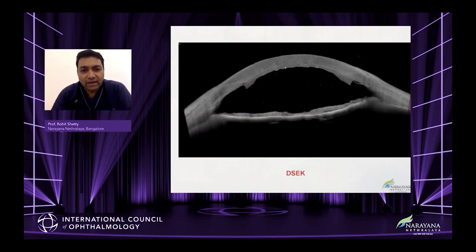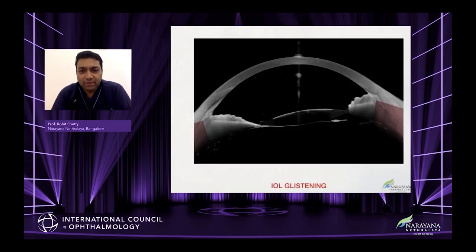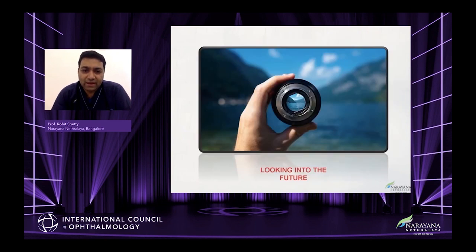We can see that this can be used by the cornea surgeon also, and the cornea surgeon also can look at multiple things: the host junction, the anterior chamber depth, the lens thickness. For the Intacs surgeon, the role of how the Intacs are placed, and the depth of the Intacs can be looked at. And this is a lens glistening, IOL glistening in one of our cases, and we can see how it looks.